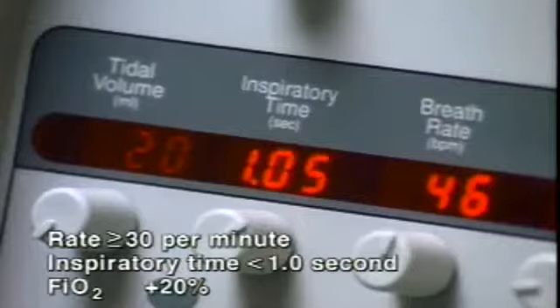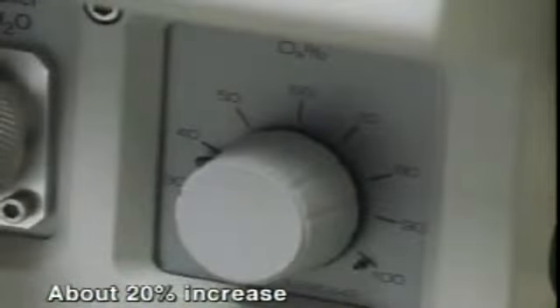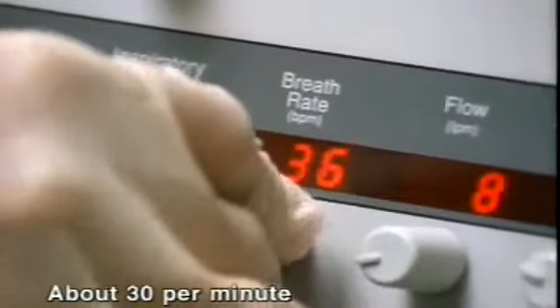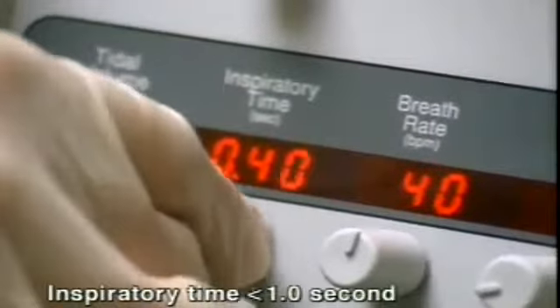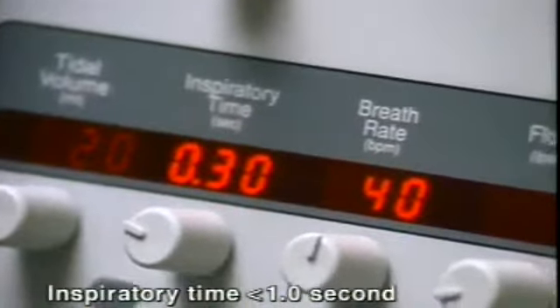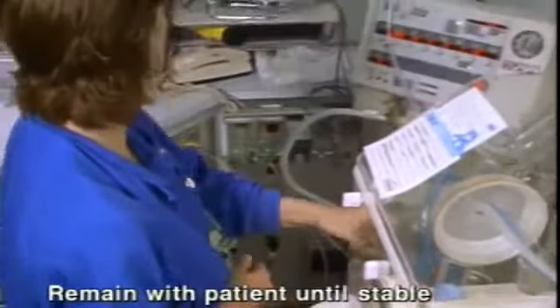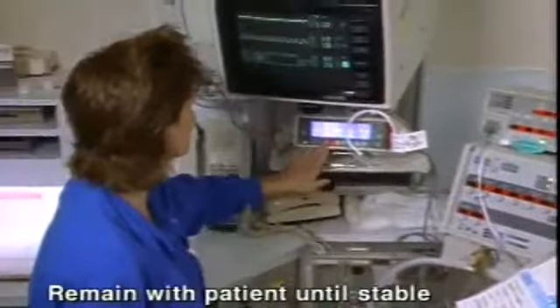In clinical studies, ventilator settings were different for repeat doses than for the initial dose. Increase the concentration of inspired oxygen by about 20%, or an amount sufficient to prevent cyanosis. Set a rate of at least 30 per minute with an inspiratory time of less than 1 second. You can always adjust these settings to ensure adequate oxygenation and ventilation. After dosing, remain with the patient until stable. Change ventilator settings as compliance improves, or if you detect acute deterioration.